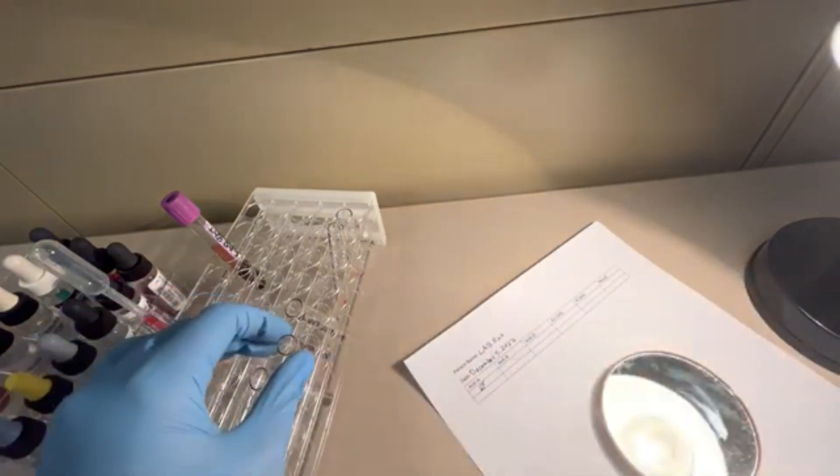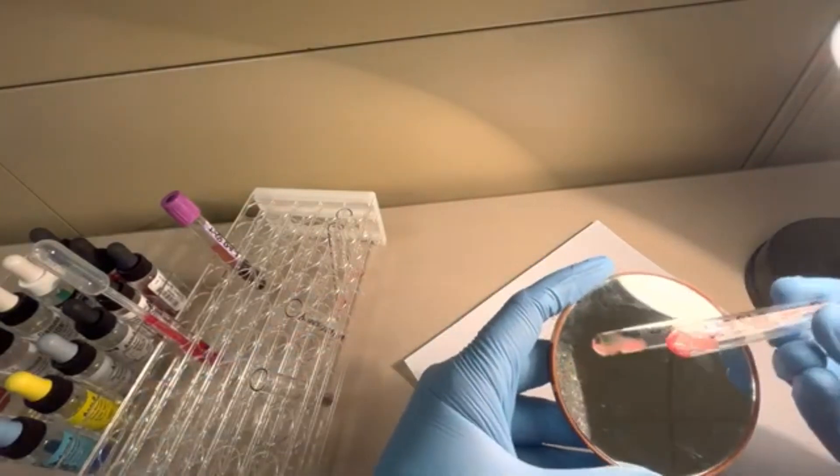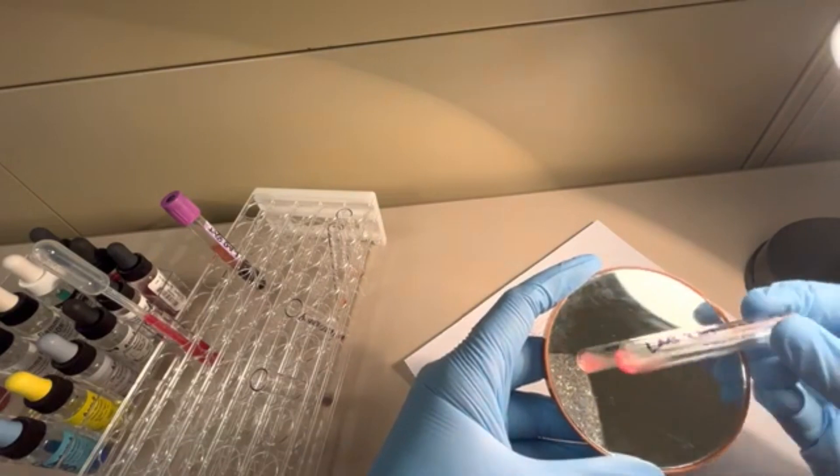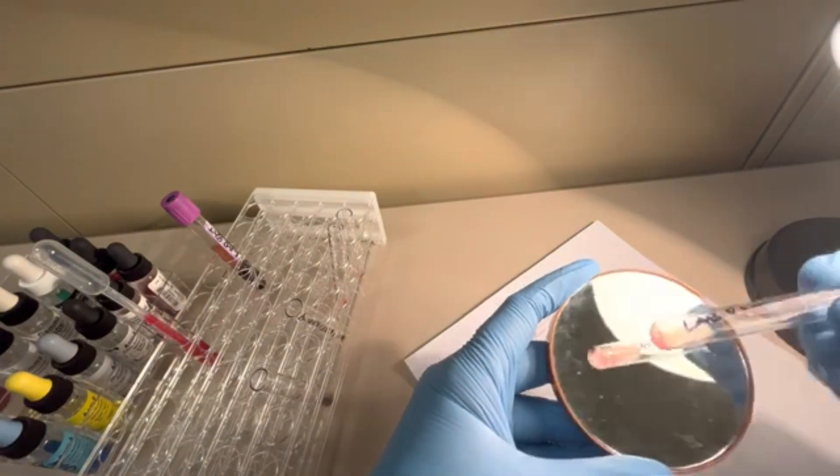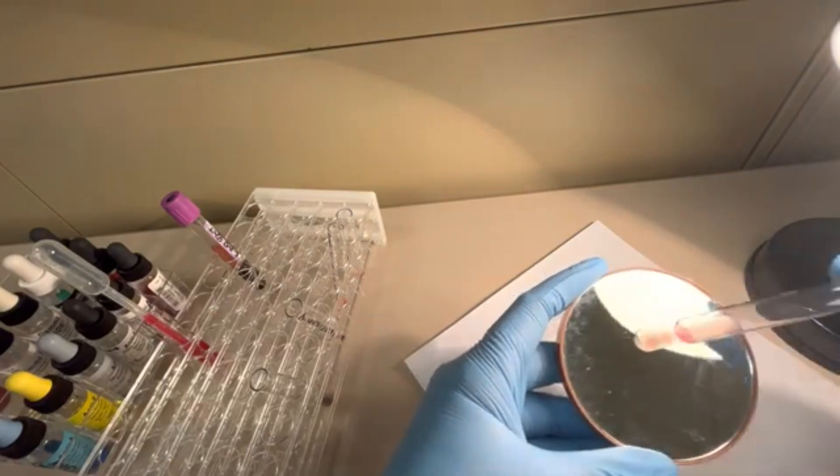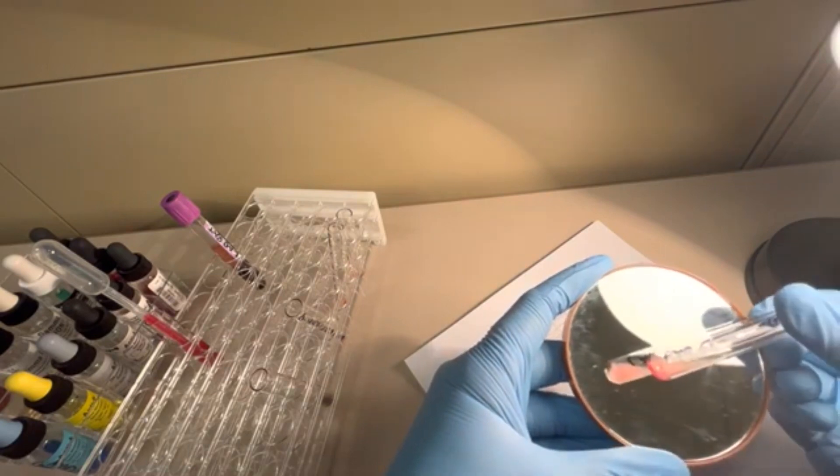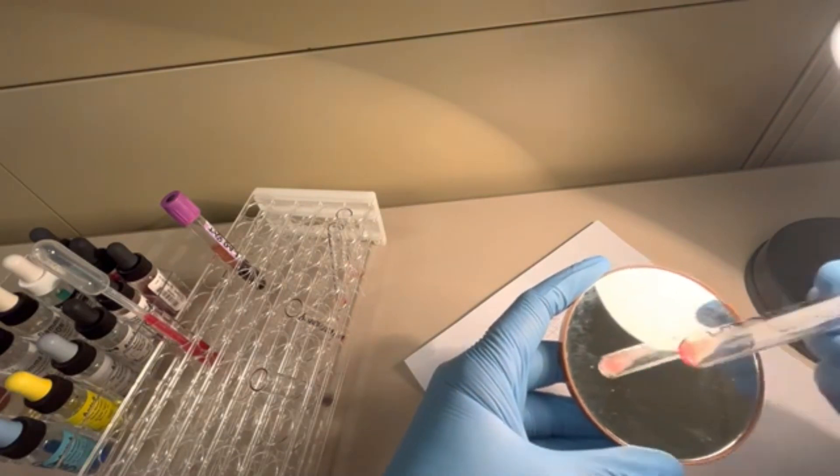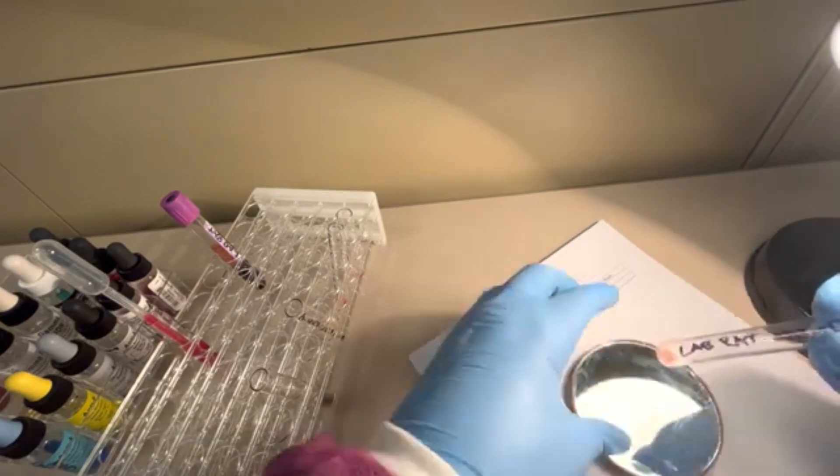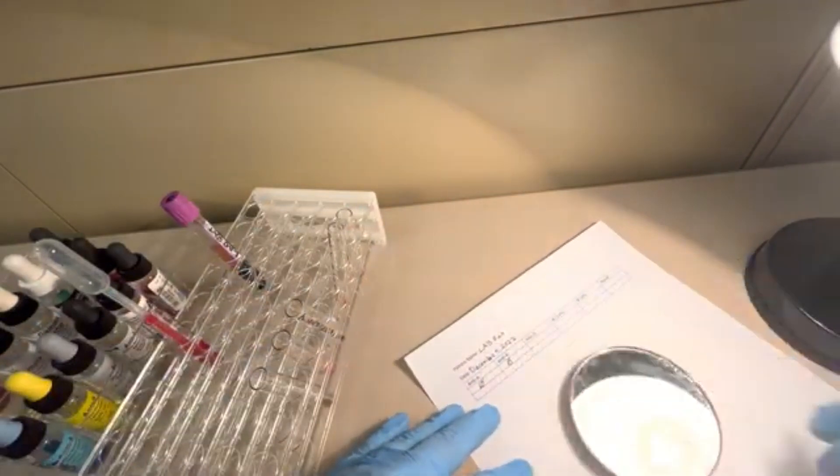Now we can move on to the next tube, anti-B. You can see that button, that red cell button came off. There's no agglutination whatsoever. This is a very distinct and clear negative result. We're going to write negative for this patient.